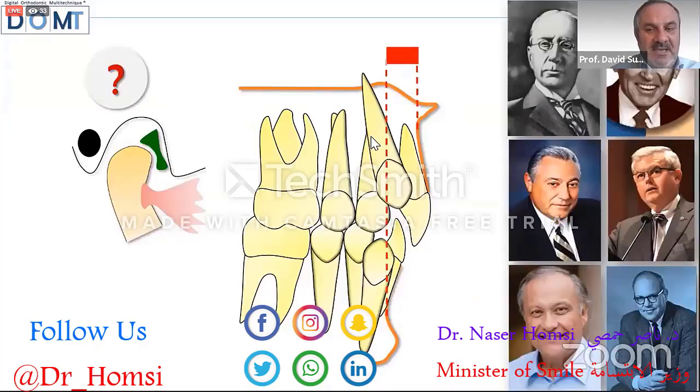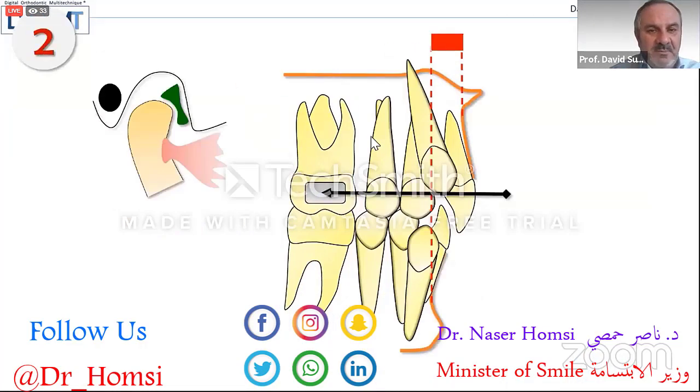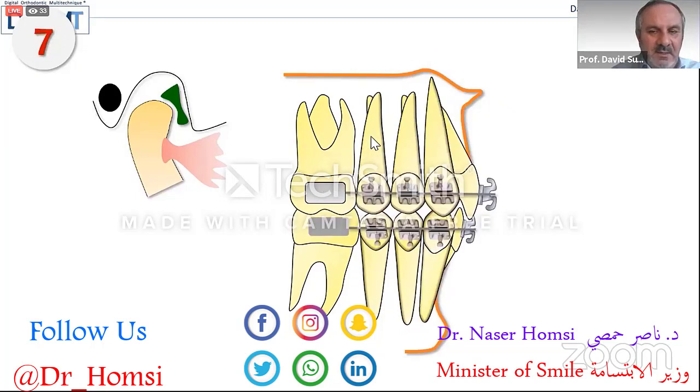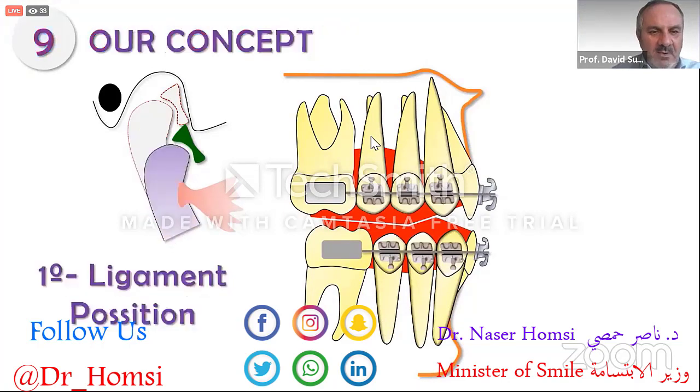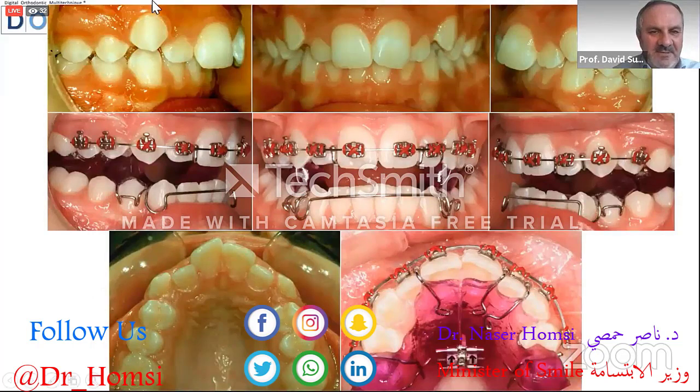For this reason, in a patient, the treatment is first to correct the molar, second to correct the bite, and third to put a functional appliance. And this is, for example, a patient.